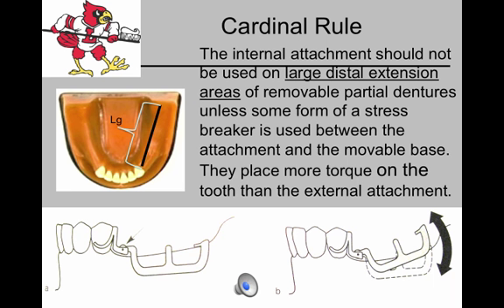The internal attachment should not be used on large, long distal extension areas of removable partial dentures, unless some form of stress breaker is used between the attachment and the movable base. They place more torque on the tooth than the external attachment.